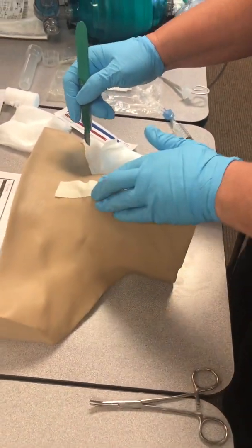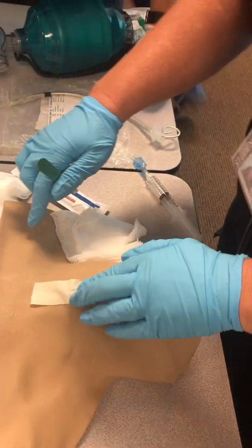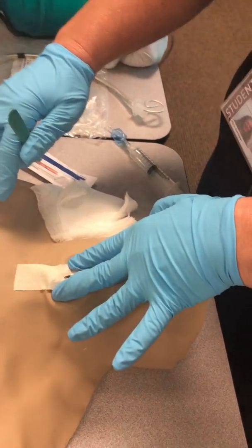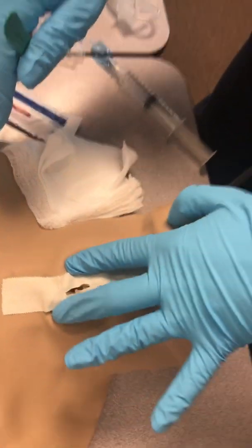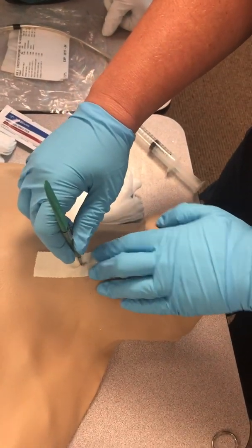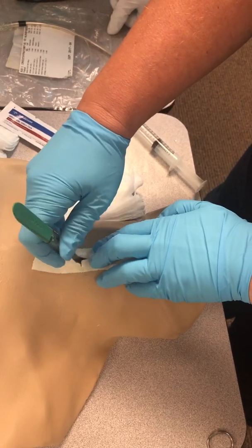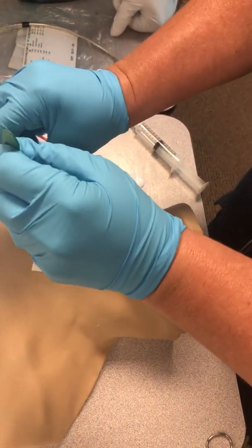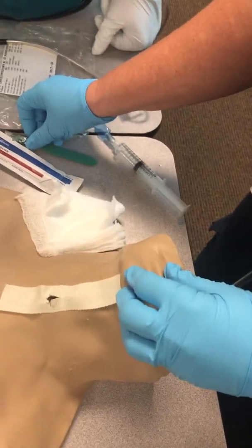On a real person, you would spread that skin open and visualize the cricothyroid membrane — it would appear as a nice white, shiny sheet of membrane. Then puncture it horizontally with the scalpel. Remove the scalpel, flip it, and use the other end to dilate the opening.